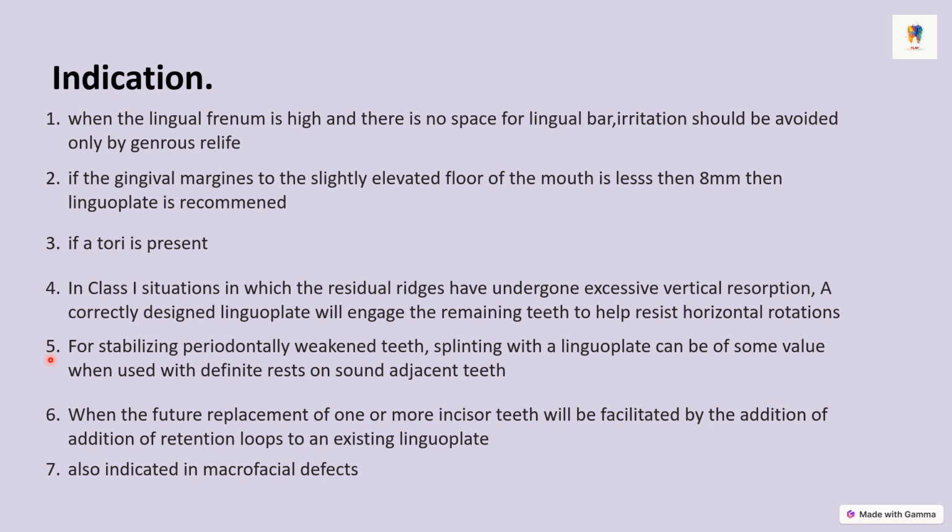You see that in future some of the teeth have to be extracted, so you go for a lingual plate because you know you can add a tooth on the existing lingual plate that you have already given. So when you are going for a future replacement, you go for a lingual plate. It is also indicated in maxillofacial defects. These are the 7 indications of a lingual plate, in which conditions you go for a lingual plate rather than a lingual bar.